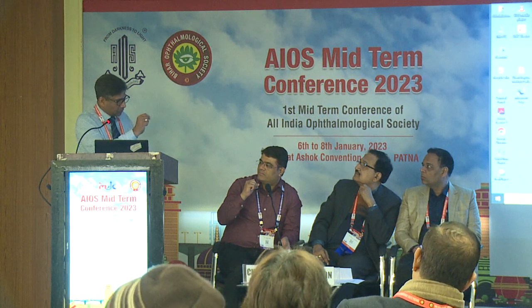Even if you're planning a small rhexis, I have seen Dr. Pradeep Mahanto doing that. Instead of the small rhexis you are attempting, because of the intralenticular fluid, before you complete the small rhexis, it can run out. No, it doesn't run out. I have hundreds of videos and it works very well. I do it with micro forceps. And once you have the small rhexis, you can decompress, and it's important to decompress from all the ports. Not only from the main incision, go from the side port, because you need to decompress as much as possible.